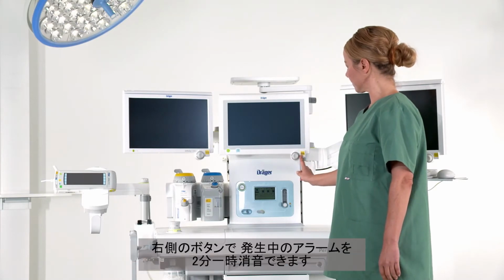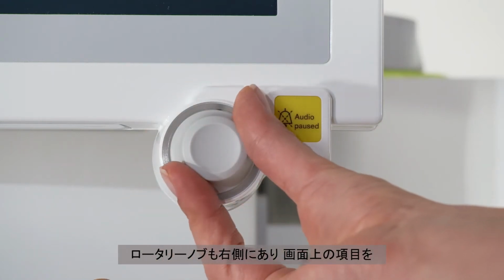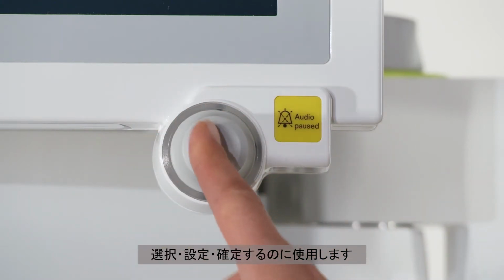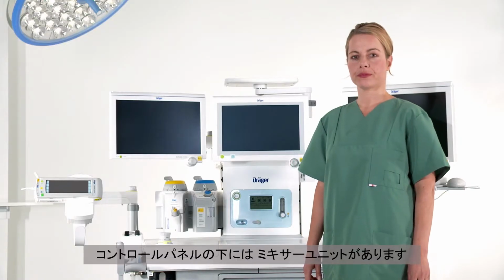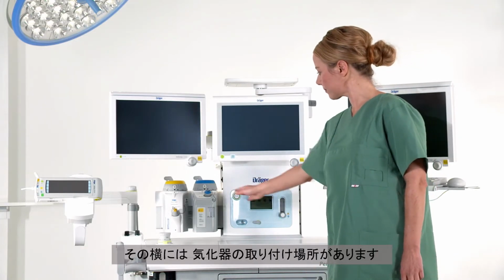A button on the right-hand side allows you to pause active alarms for 2 minutes. The rotary knob, also situated on the right side, is used to select, set and confirm items on the screen. Below the control panel, you will find the mixer unit. Next to it are the mounts for the vaporizers.